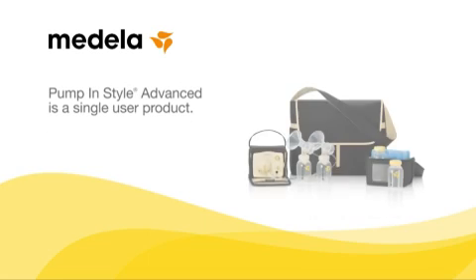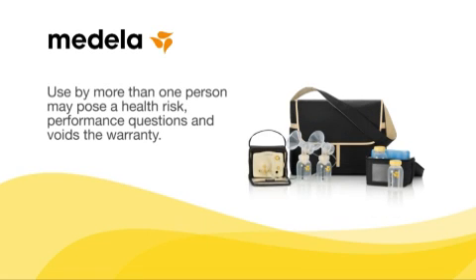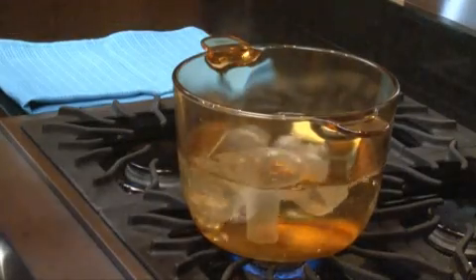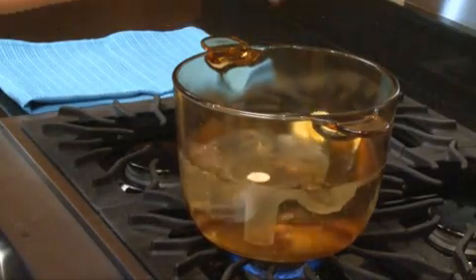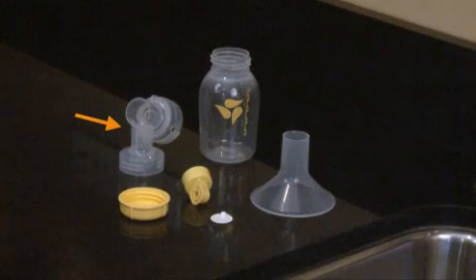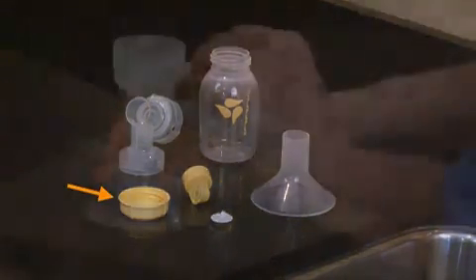Pump in Style Advanced is a single-user product. Use by more than one person may pose a health risk and performance questions and voids the warranty. Before using your Pump in Style for the first time, disassemble and boil all the parts that come into contact with the breast and breast milk: breast shields, connectors, valves, membranes, bottles, and caps.